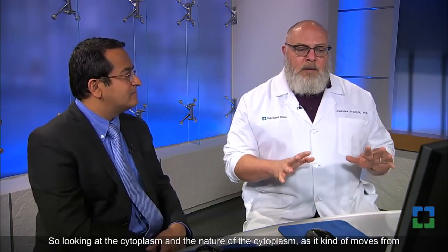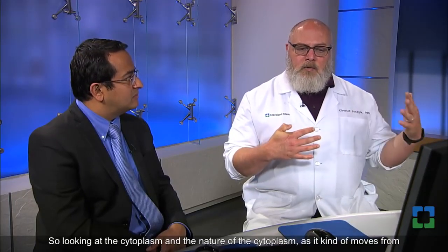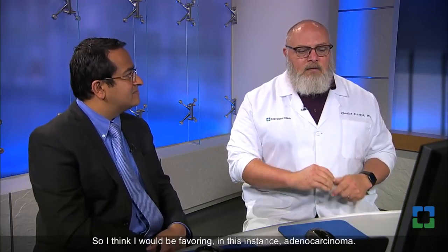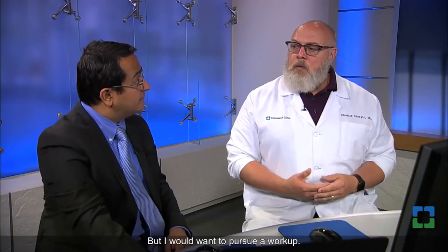So looking at the cytoplasm and the nature of the cytoplasm as it moves from cell to cell can be helpful. So I think I would be favoring, in this instance, adenocarcinoma, but I would want to pursue a workup.